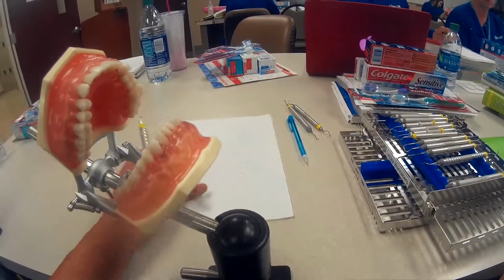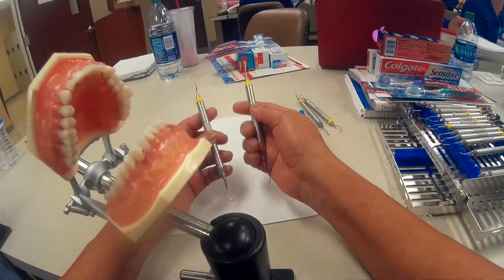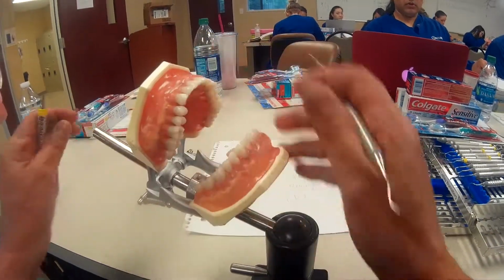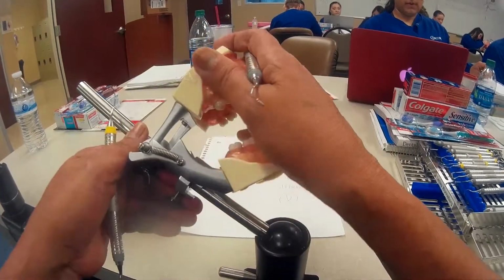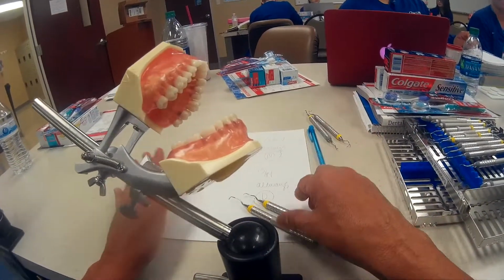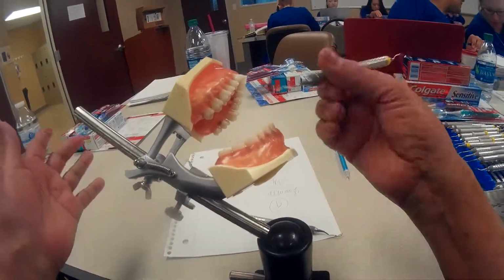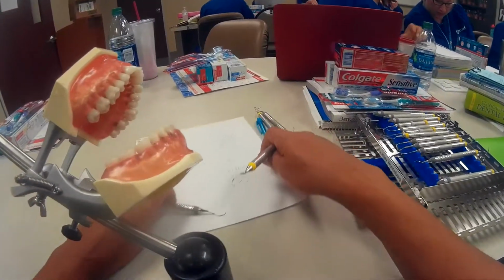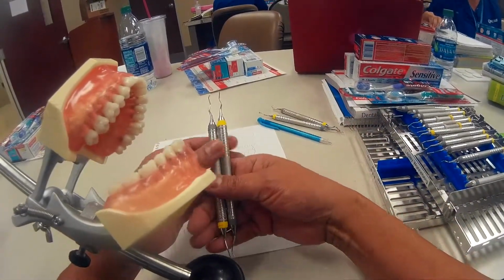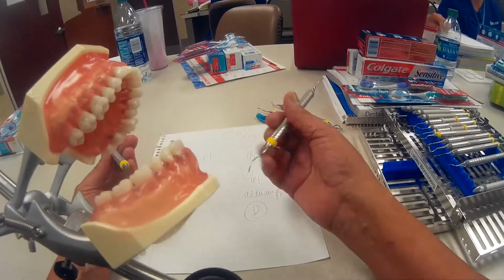So somebody at Hu-Friedy got the bright idea that they were going to just combine them, because when you're working on a sextant, instead of having two instruments there on your bracket table, you would only be using one to work on mesials and distals, all right? Because it would just simplify your life a little bit. That being said, we have what we call a modified Gracey, which is one end mesial, one end distal.